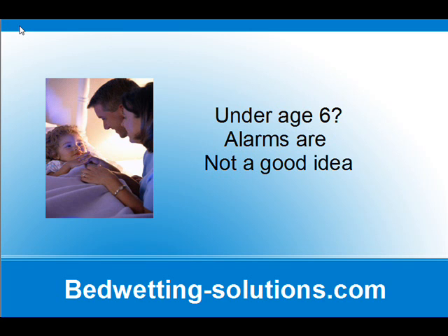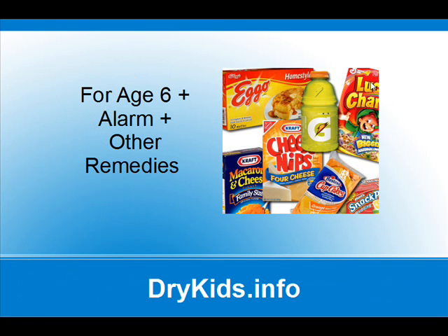For children over age 6, an alarm used on its own often doesn't work because the instructions are inadequate. Alarm conditioning should be combined with behavior modification and bladder toning. That's by far the most effective method. Using an alarm alone usually takes about 6 months to dry, and people give up before that time. My little clients get good results in 3 days and complete dryness in an average of 8 weeks. That said, if you need to buy an alarm, here are a few pointers.